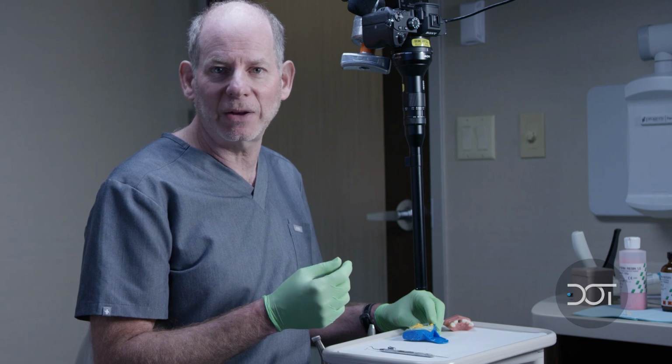so that we can keep that soft tissue supported that we worked so hard to create, as you remember from the implant provisional exercise. All right, dental online trainers, that wraps up the open tray implant impression technique.